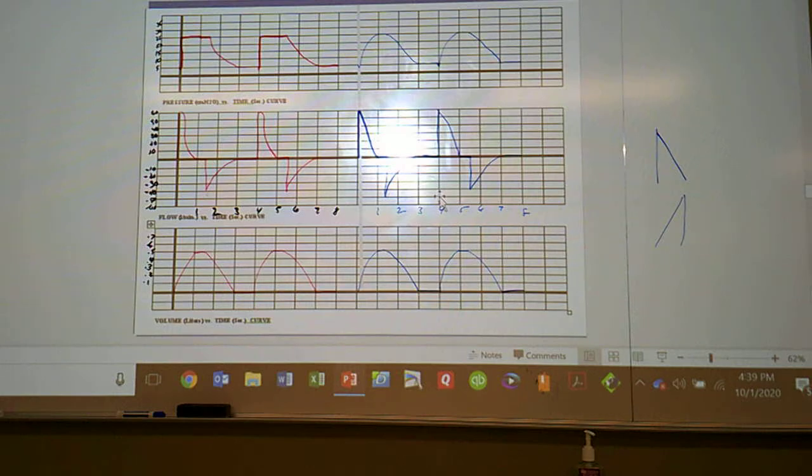Did you already do the flow too? You already did the flow here? The volume? Yep. Oh, cause it went up to 500. You just need to practice some more. Goes up to 500, holds it there for a half a second, and then exhales out. If you notice, the flow, the volume, and the pressure all are aligned. It's just matching off the tone.